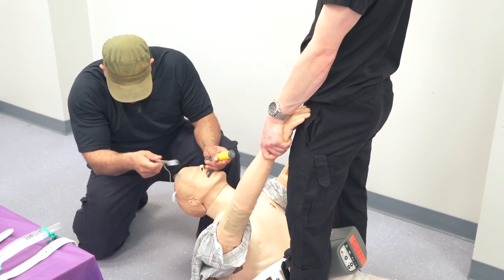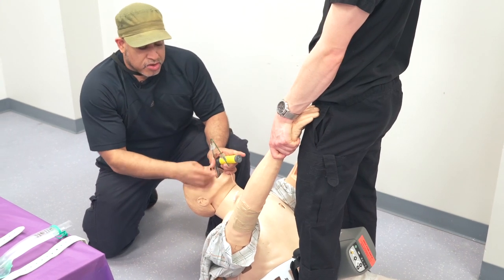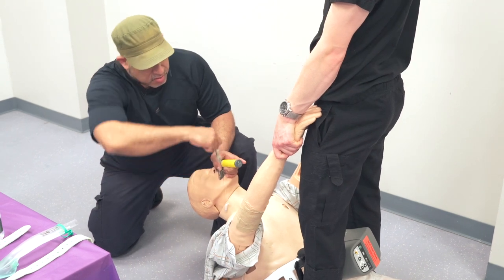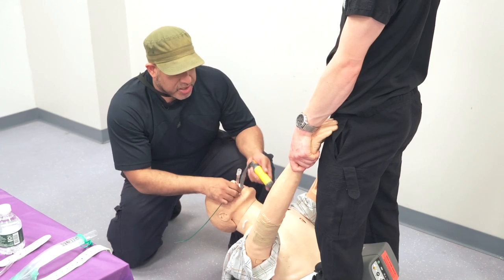So the cords. Intubate. Again, I'm going to use my thumb. Grab. Lip line 21, 22. And it's in. The other ways to reassure first pass success.